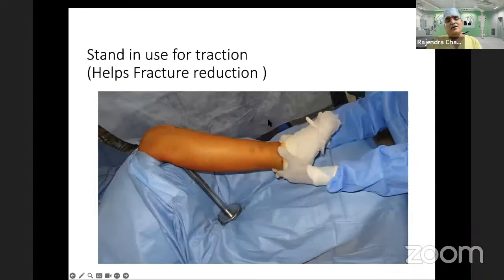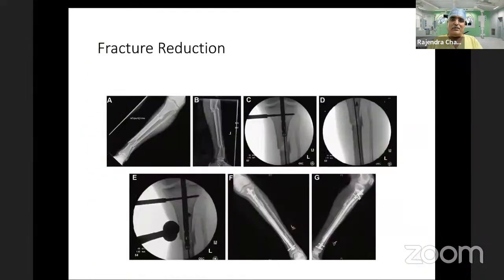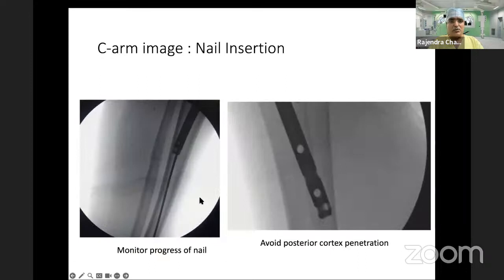And that is the way you can reduce your translation if you're doing nailing in extension, so that you can translocate or shift the patella, and the axis of the guide wire and the axis of the nail are quite comfortable. And this is what I wanted to present with the poller screws. And then you can use a poller screw. And what Harjot asked was, when there is angulation happening with the guide wire, which is flexible, you can use either a hammer to shift it onto one side, put a poller screw, use all your methods and give traction in appropriate alignment. And then the final site of the guide wire where you want to land is another good thing to avoid angulation. This is the picture during the nailing procedure.